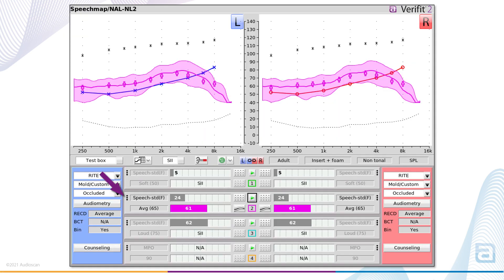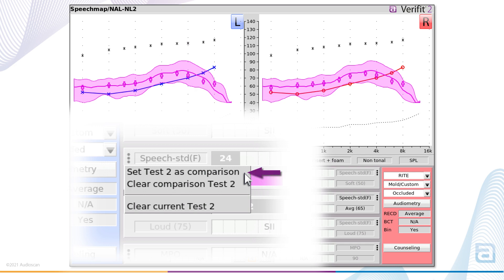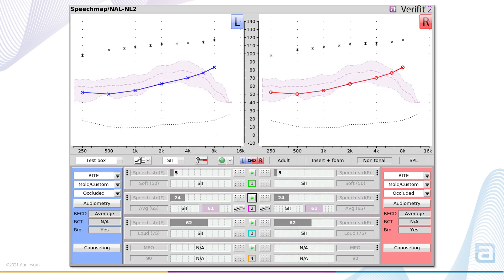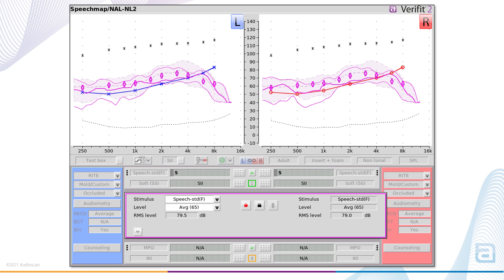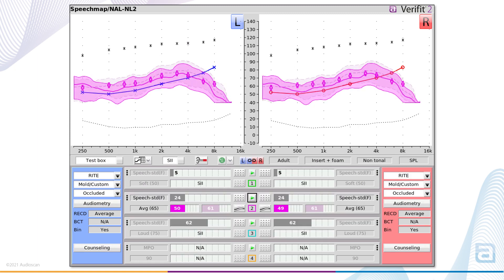A new pop-up menu in speech map provides access to the comparison test function. With a completed test shown on screen, selecting 'set test to comparison' — in this case test slot number two — will move the current test results into the comparison slot. The curves and curve shading will be shown as a lighter color to identify the comparison data. A new test can be run in the same test slot and the comparison data will be visible in the background during the measurement. Once complete, both tests will remain visible. Note also that a second SII Audit Bar has automatically been added, so the speech intelligibility index values for both previous and new curves can be displayed.